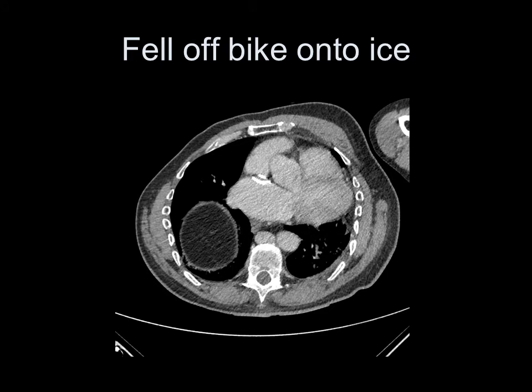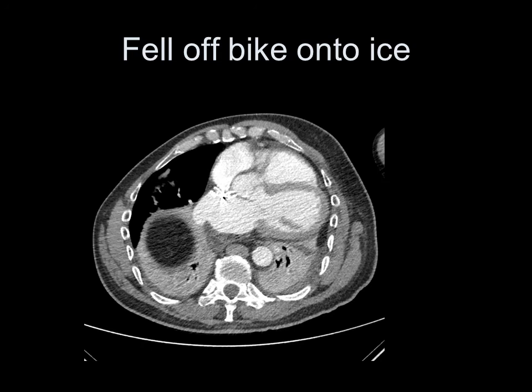Here's a patient who fell off their bike onto the ice, and they did sustain several rib fractures and clavicular fractures. The first scan here, which was performed on their admission, doesn't actually show any significant abnormality at the lung bases. And then the repeat scan performed on the 23rd of January shows us extensive airspace opacification in the lower lobes with the clustered air bronchograms, very much the appearances of bilateral basal atelectasis. So not consolidation. Again, the patient was promptly discharged in this case.